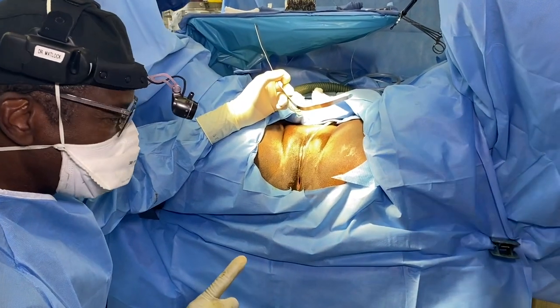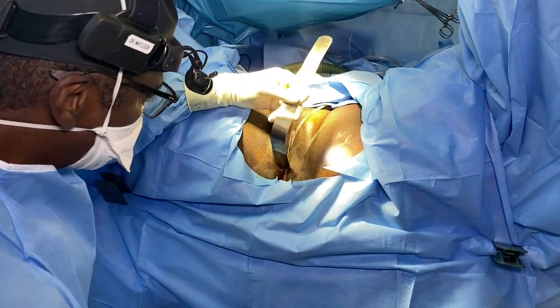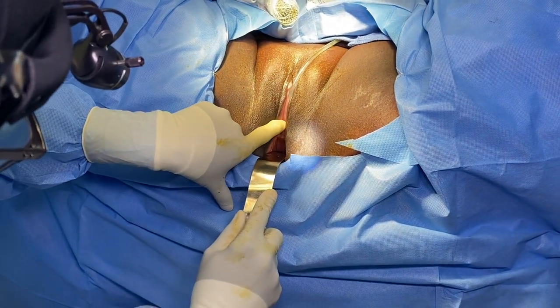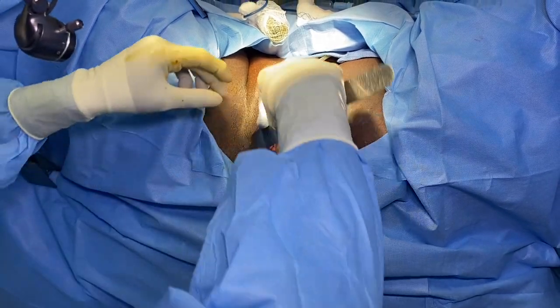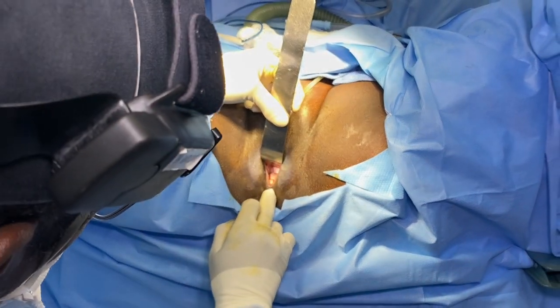Okay, on the patient, we're going to do a laser vaginal rejuvenation procedure. The patient has had two children. She has stress urinary incontinence. She has what we call a cystourethrocele, where the bladder and urethra are falling down here. This is the urethra here, bladder here, and then a rectocele, meaning that the rectum is herniating up here, and then perineal body relaxation here.